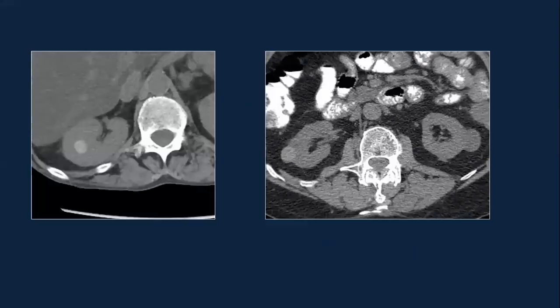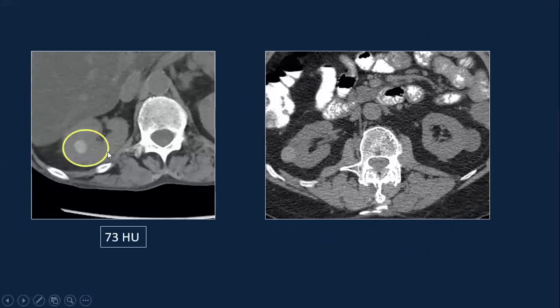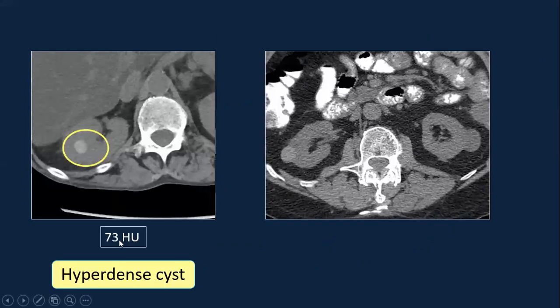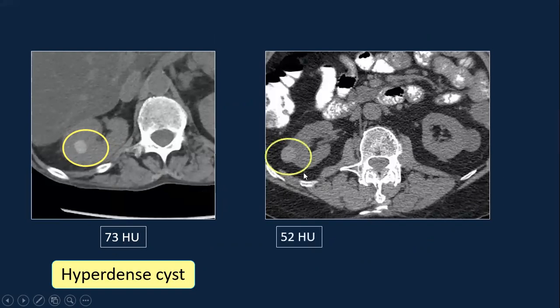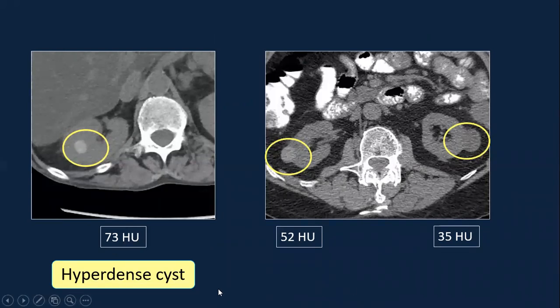Coming back to our patient, the Hounsfield unit measurement was 73, which is greater than 70, and the lesion is also homogeneous — so this is a hyperdense cyst. In a second patient with lesions in each kidney, the right kidney lesion measures 52 and the left kidney lesion measures 35. Both are greater than 20, however, less than 70.